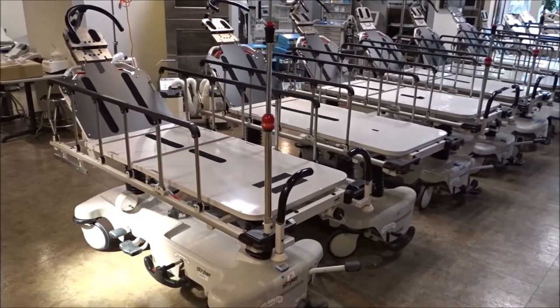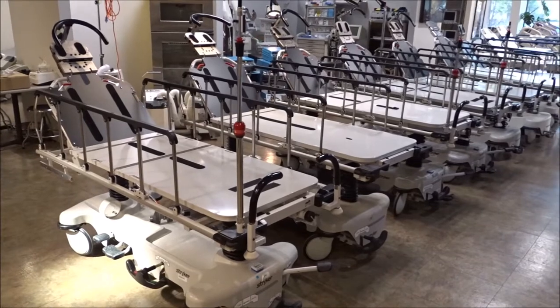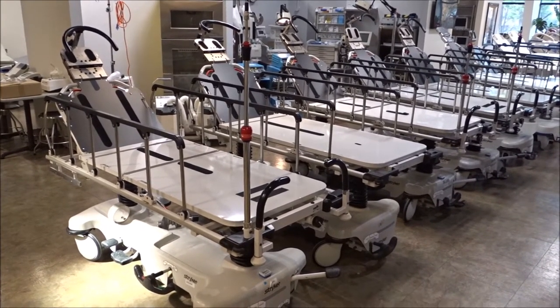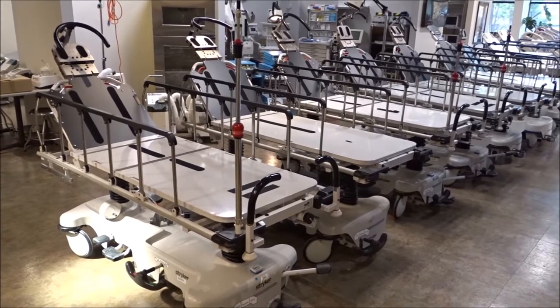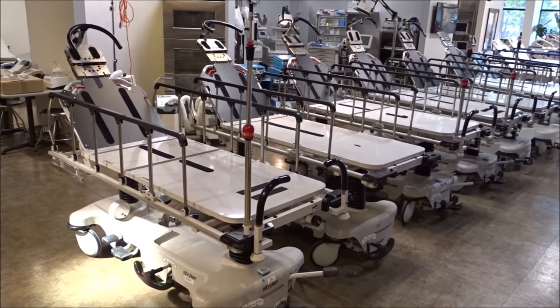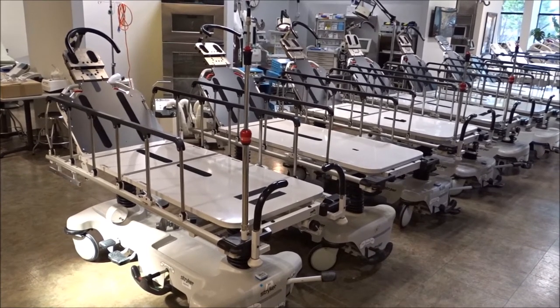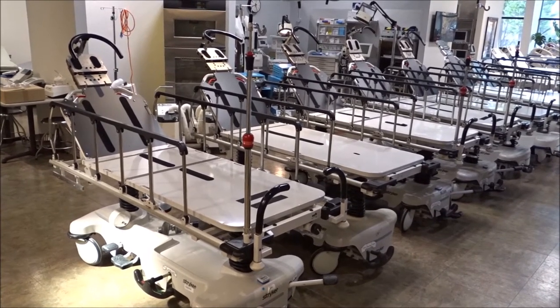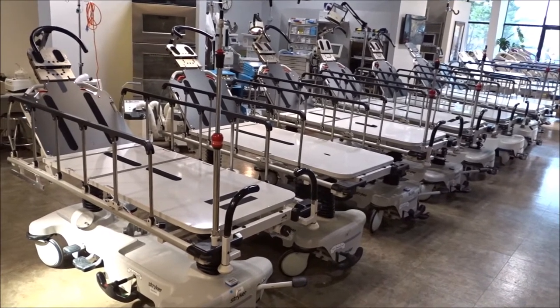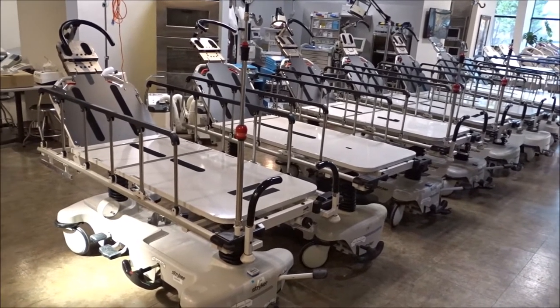We're at iMedical Equipment and Service, and we're looking at surgical stretchers — eye stretchers, also referred to as head and neck stretchers. We're looking at some of the most popular models in the used refurbished market, including the Stryker 1079s, which we have right here in front of me, and towards the back we also have the Stryker 1089s, which are also part of the Prime Series stretchers.